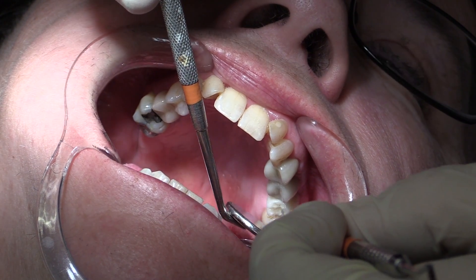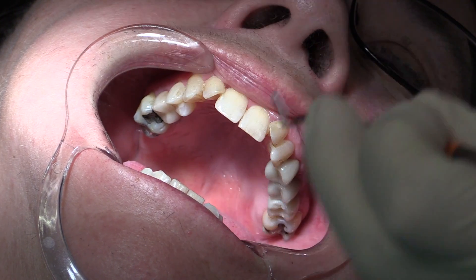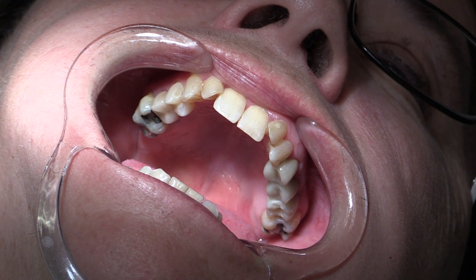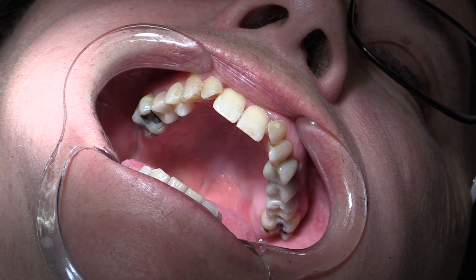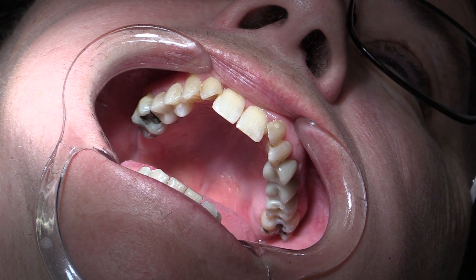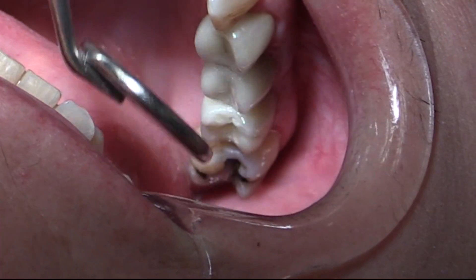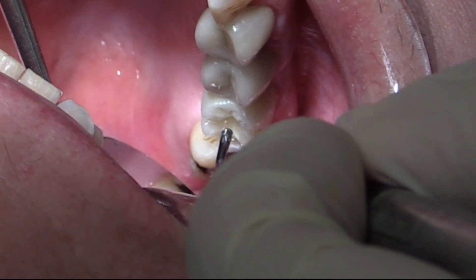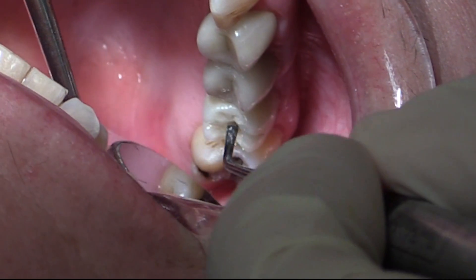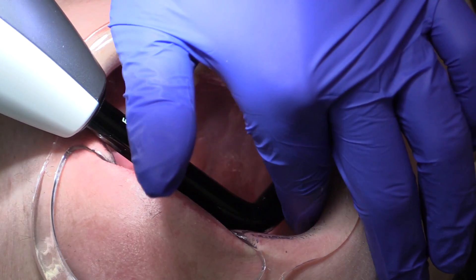The PEEK abutment gave enough volume of space to allow a generously sized crown, which will prevent food trapping around this system. If the implant is too small or not in the right position — not deep enough or too far from a tooth — you'll have food trapping. Here you can see the contact and embrasure is actually perfect, not allowing things to be trapped around this tooth. This crown is also double the strength — 1400 megapascal tensile strength on zirconia — and the 5.5mm implant has double the strength over its regular platform size.